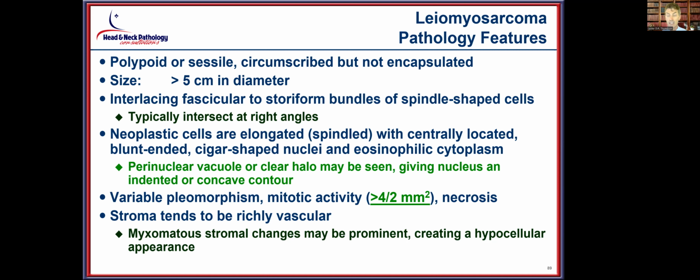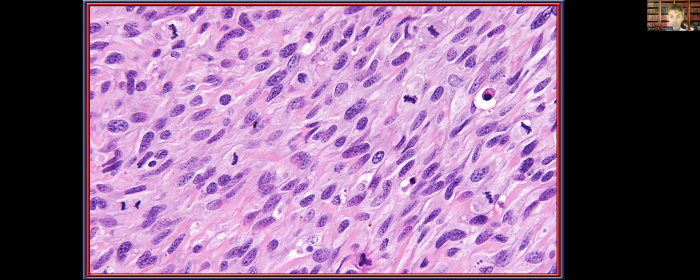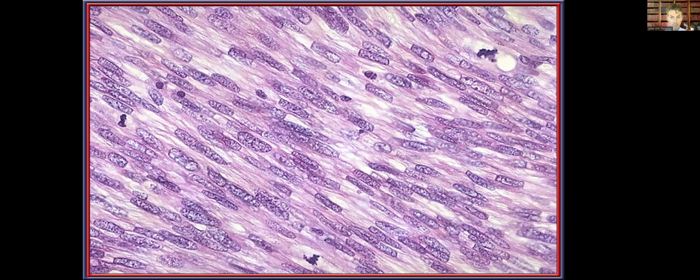The reason I say this is there is a smooth muscle tumor of uncertain malignant potential, or STUMP, category within the sinonasal tract, and that is predicated on having a lower mitotic index. And so that is something at least to be considered within this tumor group. So here is an example of bone destruction. Again, destroying the bone is a frequent finding with any of these sarcomas that develop in the sinonasal tract. Mitotic figures are easy to identify and generally include atypical forms as well.